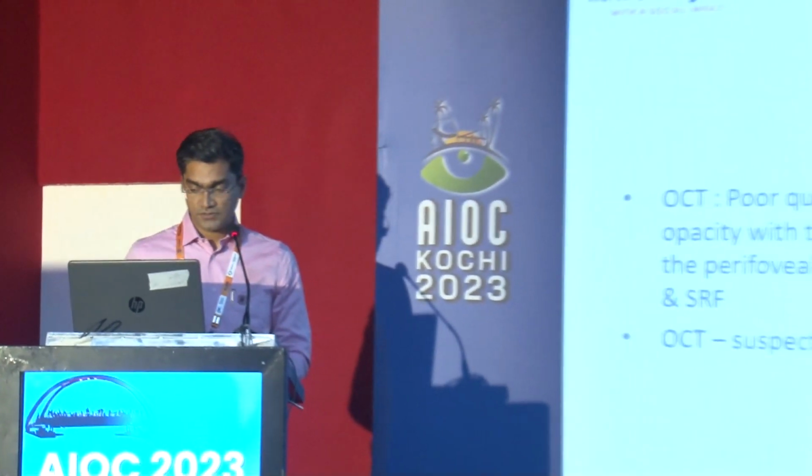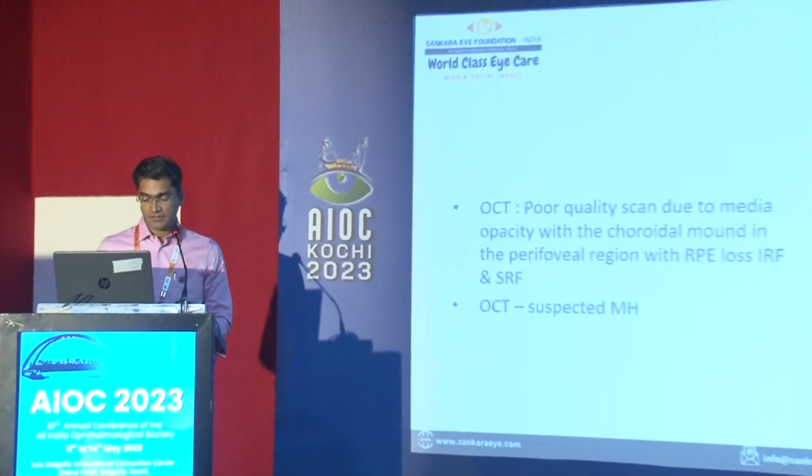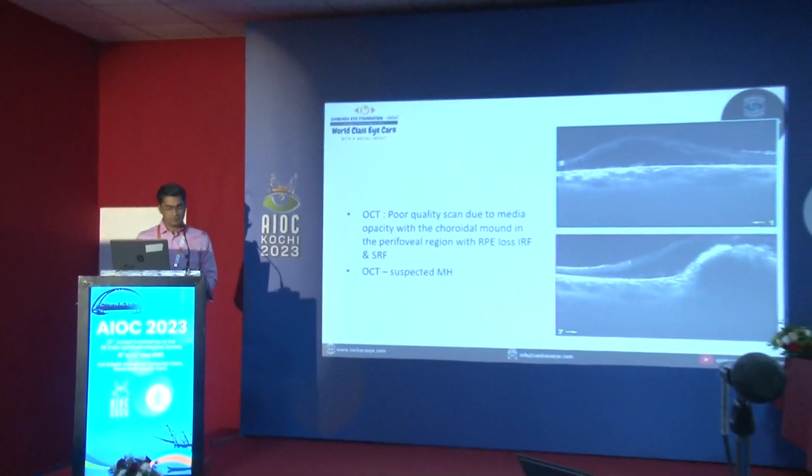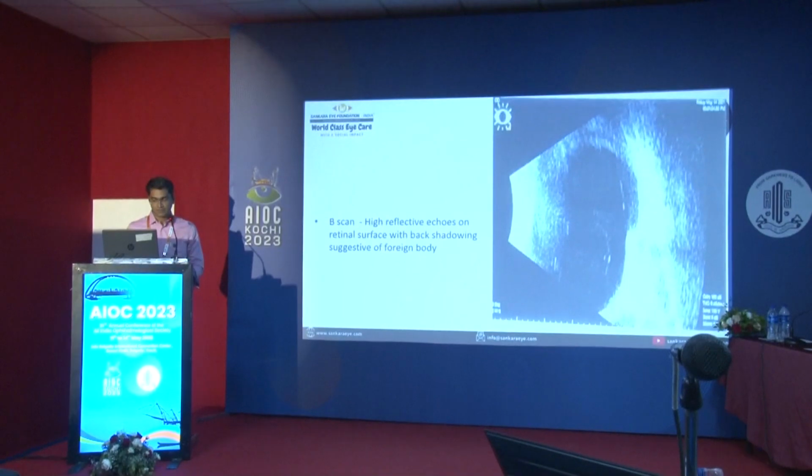The pressure is normal. This was the fundus which was hazily seen, where we can see a yellowish colored scar in the inferotemporal area of the macula. The foveal reflex was very dull. It looked like there was a macular hole. OCT was not passing over it, but this was the OCT passing over the lesion, where we can see a hyperreflective lesion in the subretinal or choroidal area, and there was intraretinal and subretinal fluid.